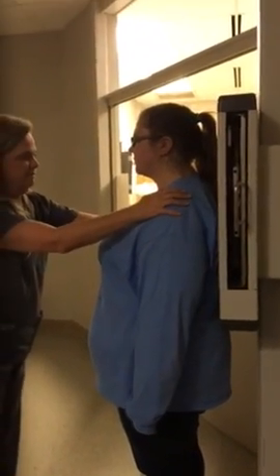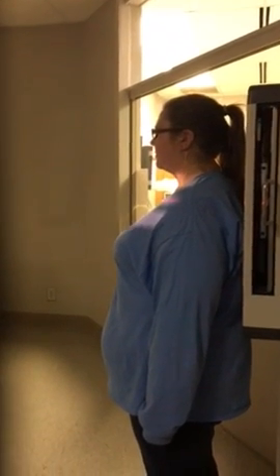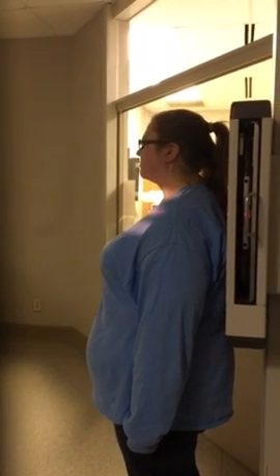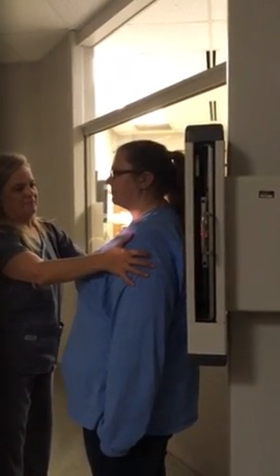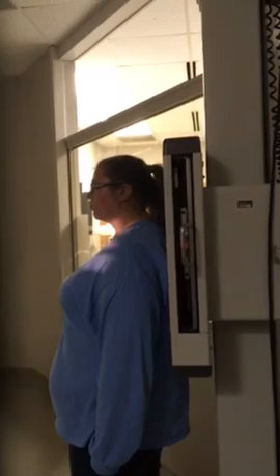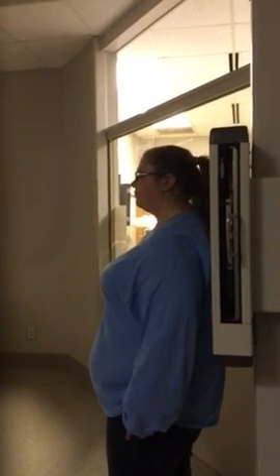Stand up, relax. Okay, so AC routine is what? With and without, right? Without first, then with. So that's AC. That's bilateral. We're getting both. If you want a unilateral, you would just do the one that's hurting. If they can't do it with the weights, you just don't do it. I always do the one without weights, have the radiologist check it. And then if he approves it, then I'll do it. Because you'll see if it's already separated, they're not going to want you to do weights.